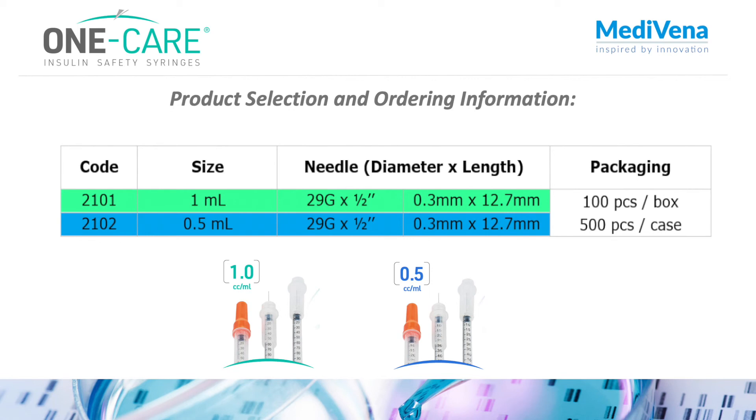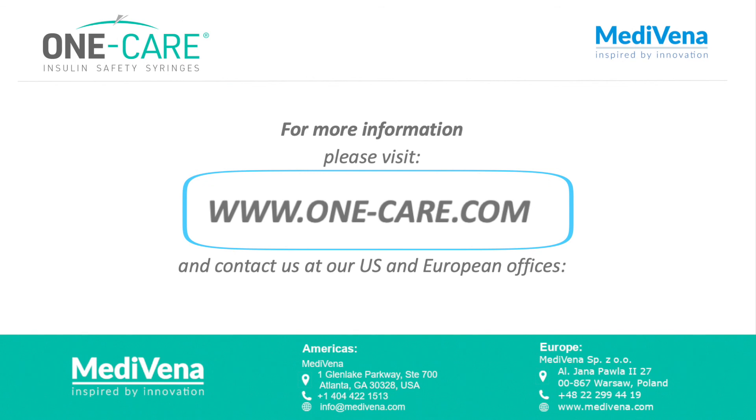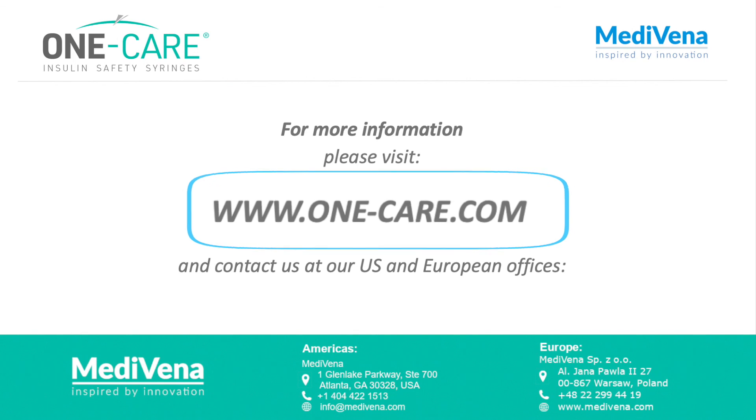One Care Insulin Safety Syringes are available in 29 gauge by 1/2 inch in both 0.5 and 1 ml sizes. For more information, please visit us at OneCare.com.